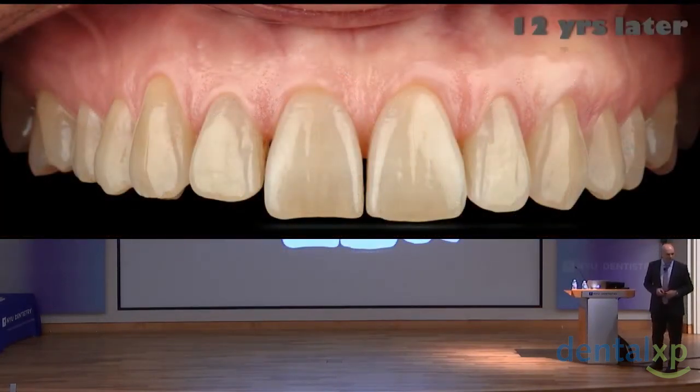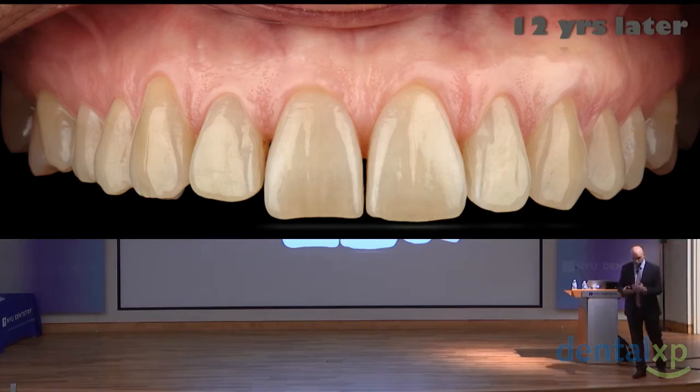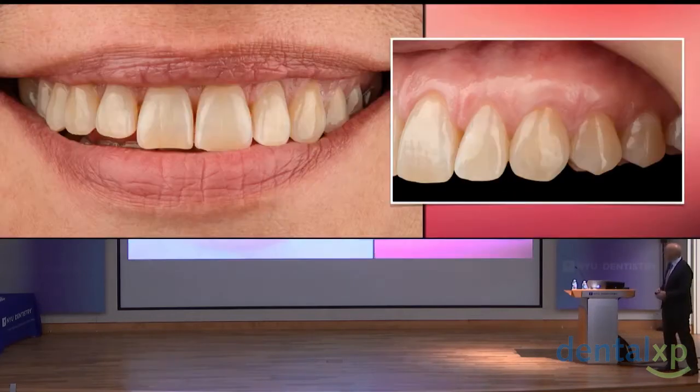Very stable result. But you say to me, okay, Ramon, but this is a shallow recession. This is a very simple recession. I understand you don't need to reposition the flap with a suture. I was thinking about the idea that if I use a lot of sutures, it takes more time for me, and it's more time for the patient also, and it is a more expensive treatment. So I use those sutures, absolutely, but not always.